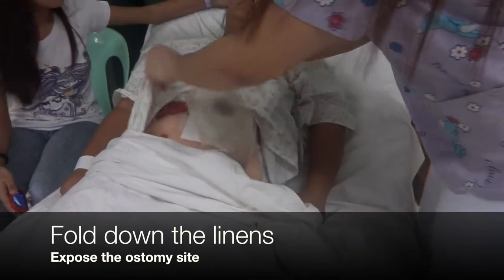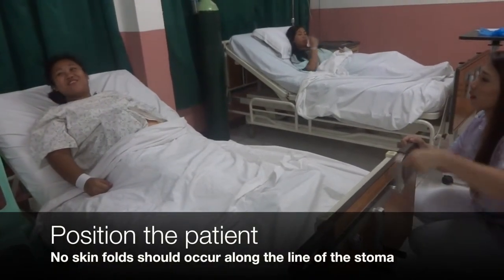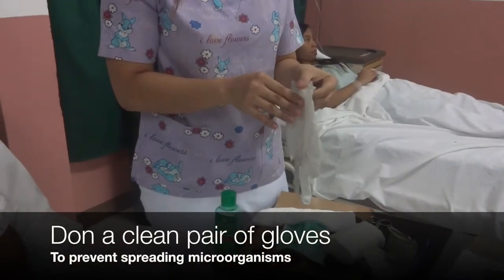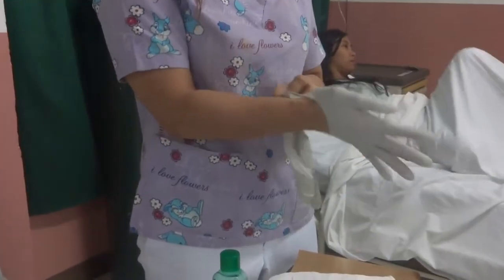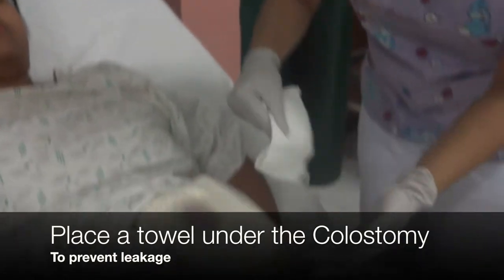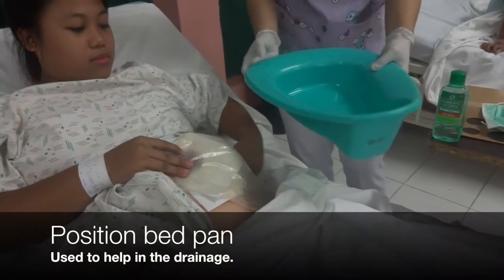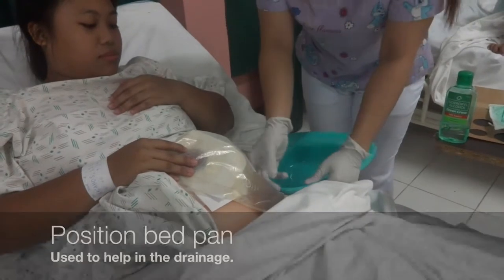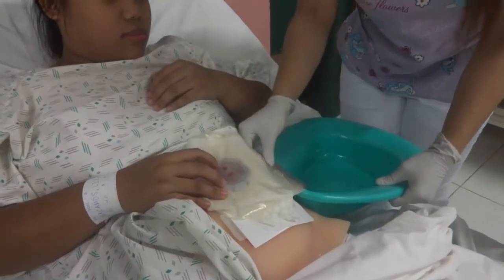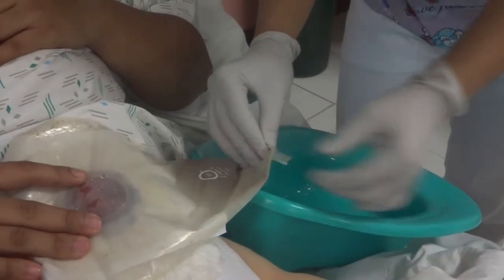Fold down the linens to expose the ostomy site. Position the patient so that no skin folds occur along the line of the stoma. Don a clean pair of gloves. Place a towel under the colostomy bag to prevent leakage. Position the bedpan underneath the colostomy bag. Open it by removing the clamp and unrolling it into the bottom, and empty the existing ostomy pouch into the bedpan.